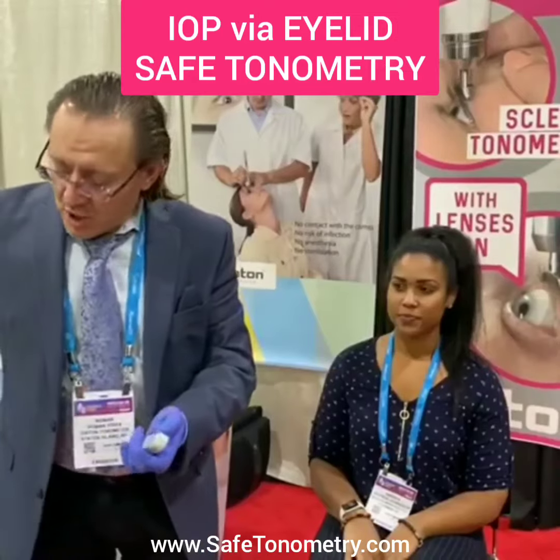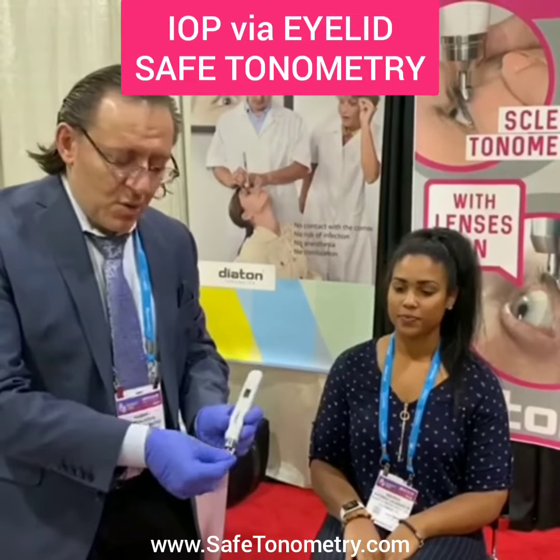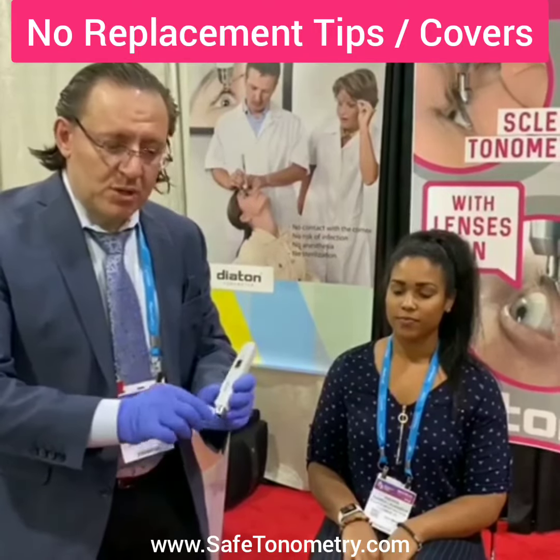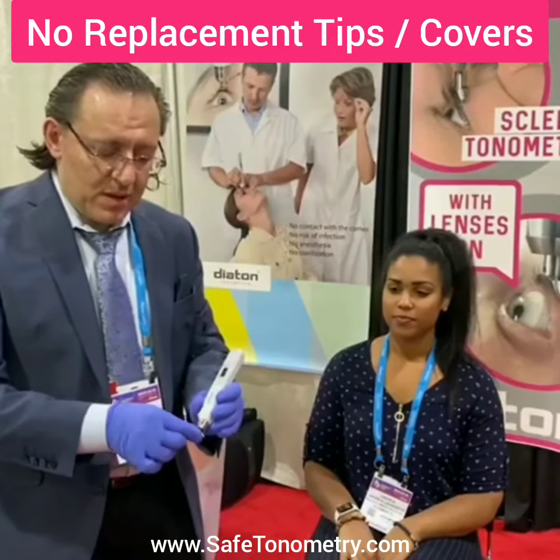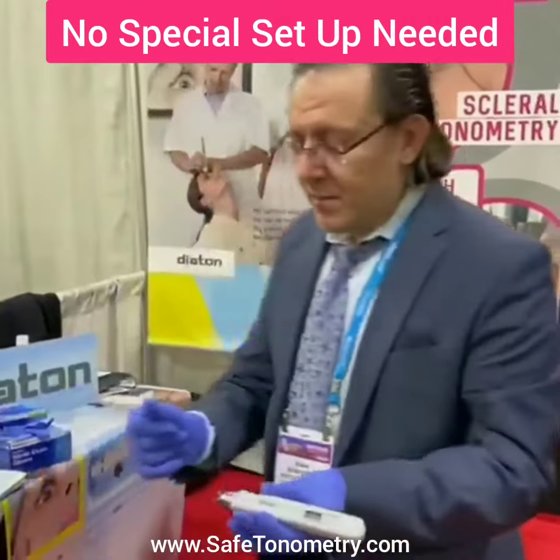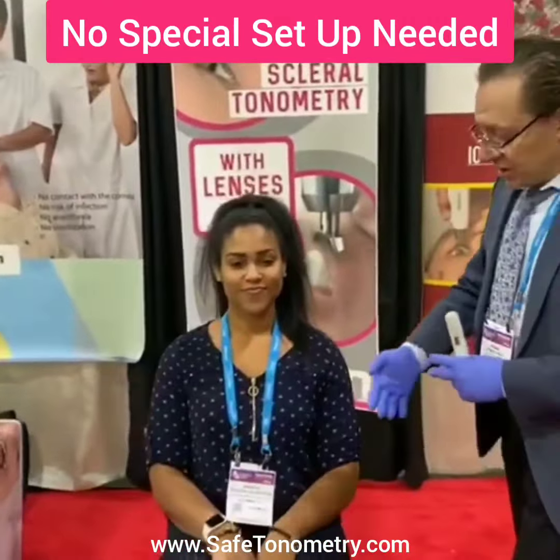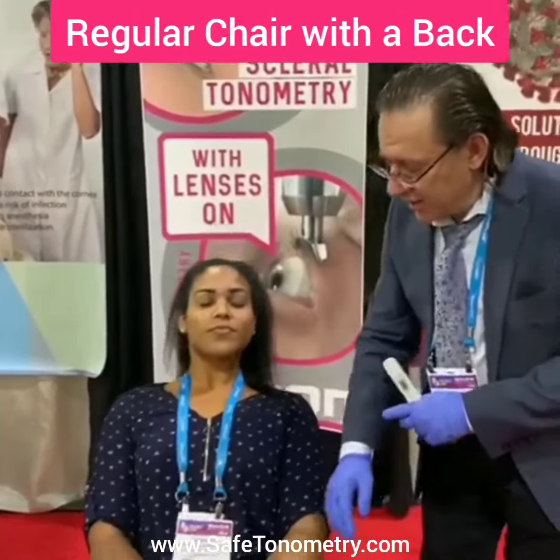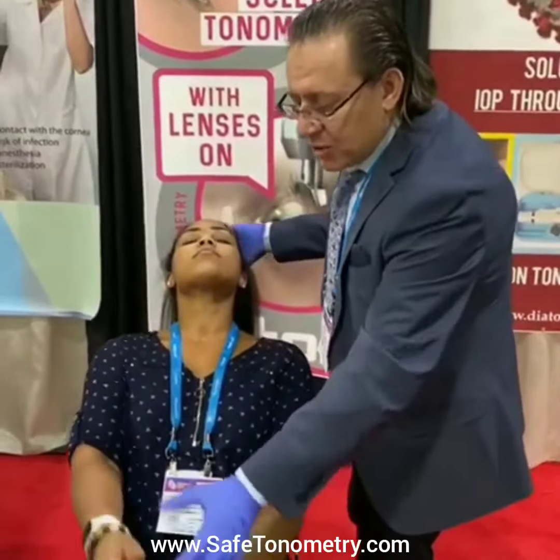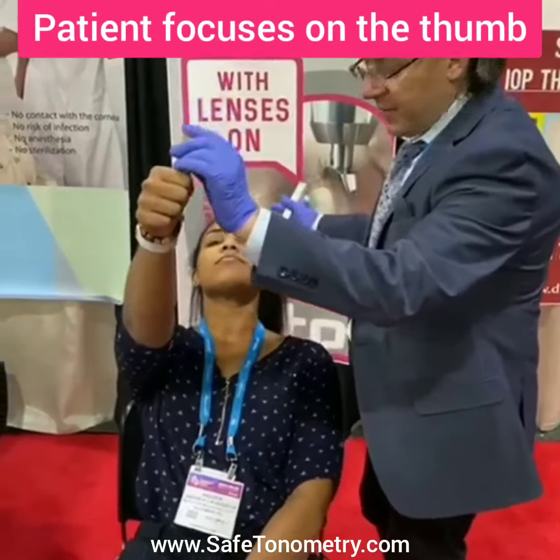The tip of the device which comes in contact with the patient will be cleaned with an alcohol swab, which is an adequate method. So now with the patient, I would ask the patient to sit a little bit closer to the edge of the chair, tilt the head back, and ask the patient to extend their thumb forward.